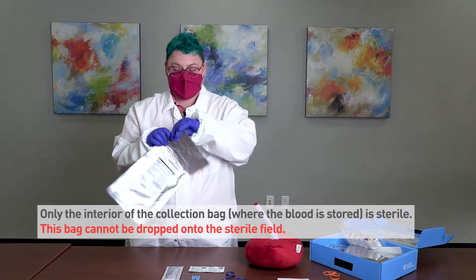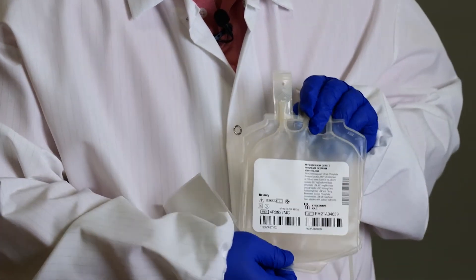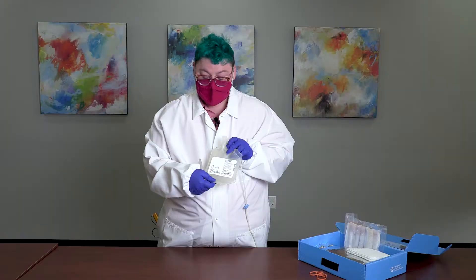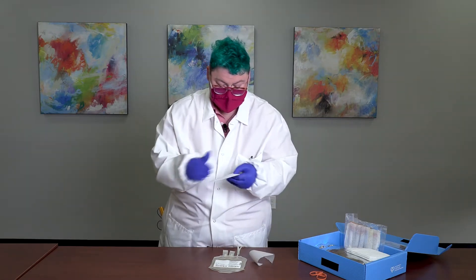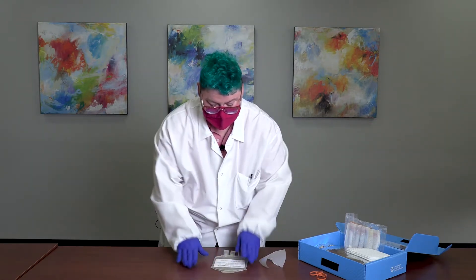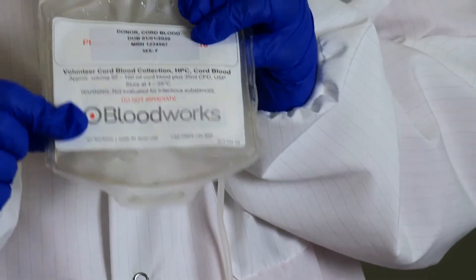When you're ready to begin the collection, go ahead and open the collection bag. Once opened, it must be used within 24 hours. Before the collection, add the base label to the collection bag. The base label notifies our lab staff that this is cord blood, since this collection bag does not indicate cord blood as opposed to adult blood. The hospital label from the patient goes directly on top. If we receive a cord blood unit without this base label, we're not able to use it, so please don't forget to include it.